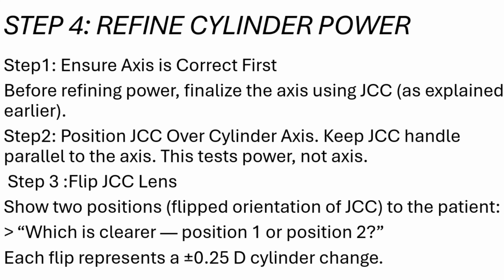In step 4, we have to refine the cylinder power. Refining cylinder power corrects the amount of astigmatism after the axis is finalized. It helps to find clarity and ensure comfort. Now we can see it step by step.